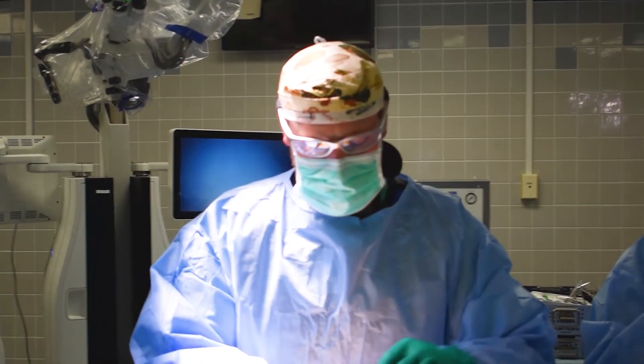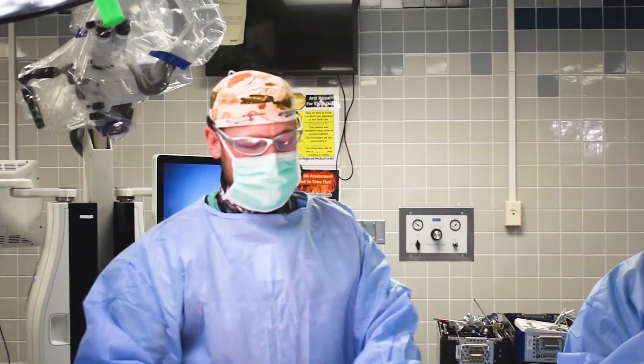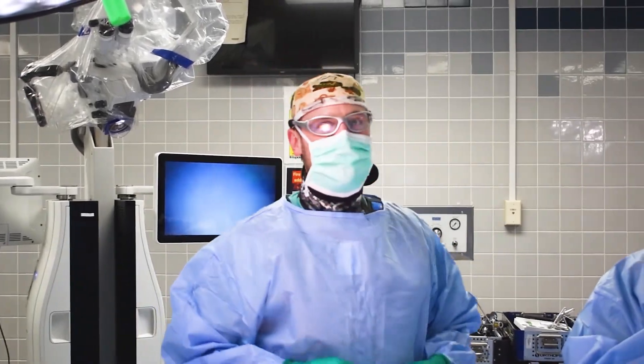Minimally invasive T-LIF gives the patient a strong fusion while also providing several advantages over the traditional open approach. Like any minimally invasive surgery, it utilizes small incisions and less tissue disruption. The goal is to reduce blood loss, get patients back to their lives and out of the hospital quicker, and aid in recovery in a much faster fashion. In addition, the cosmetic results are quite nice — patients typically prefer the two small incisions versus the big traditional back incision.